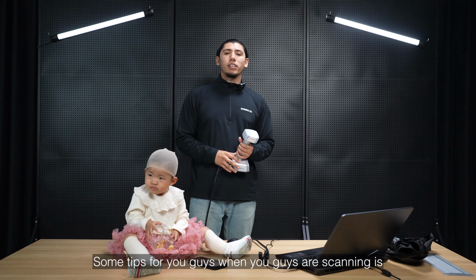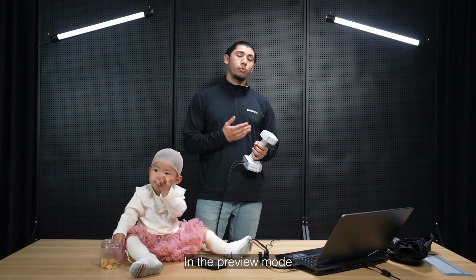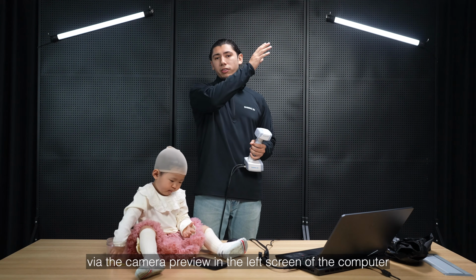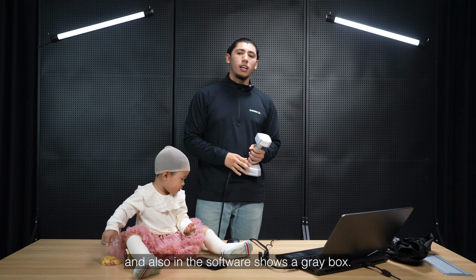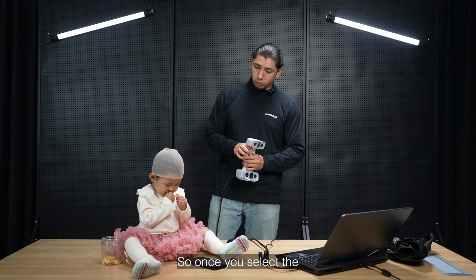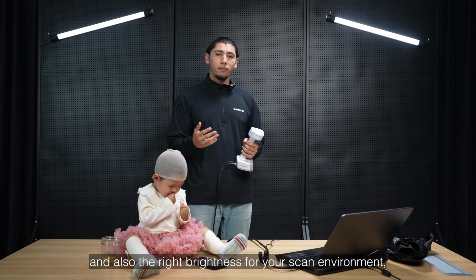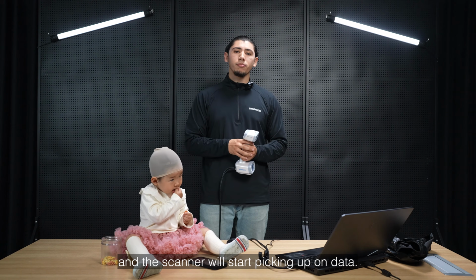Some tips for you guys when you are scanning: you can press the play button once, and that will activate the preview mode. In the preview mode, you're shown exactly what the camera sees via the camera preview in the left screen of the computer, and also on the software it shows you a gray box. Here is when you can start adjusting the brightness using the button panel here, and also the distance you're scanning at. So once you select the optimal scan distance and also the right brightness for your scan environment, you can press the play button again, and the scanner will start picking up on data.